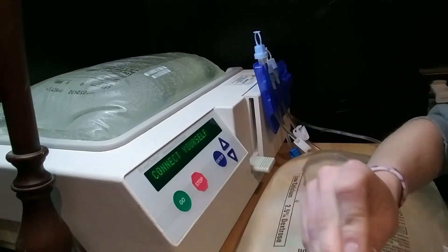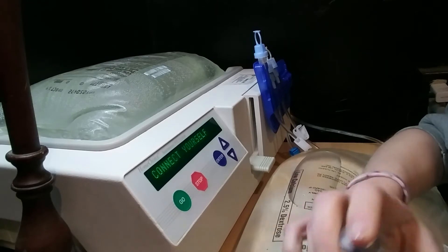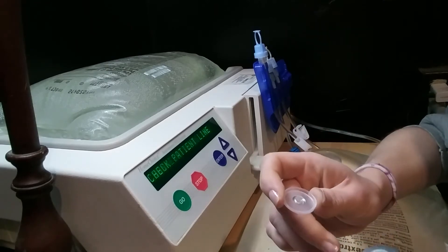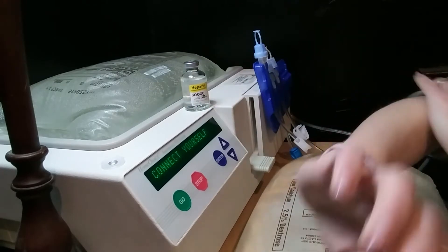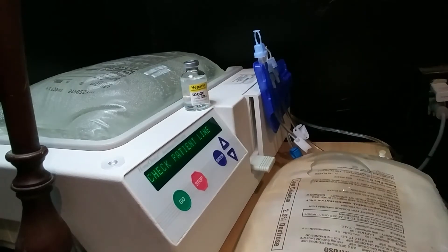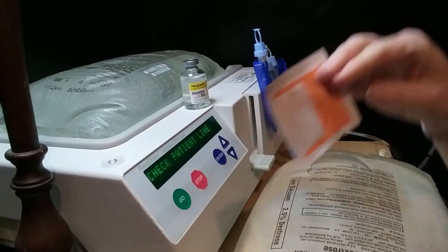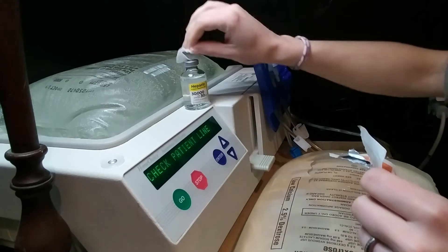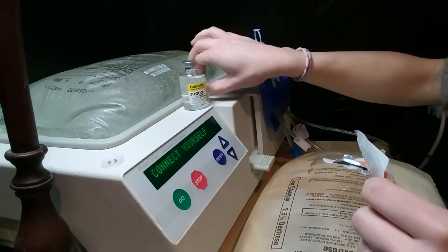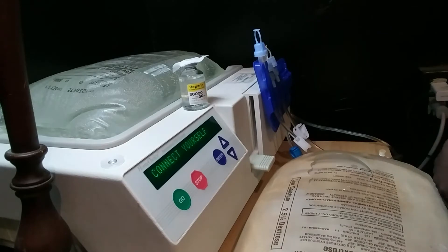Each bottle of heparin is good for a month from when you open it. I'm going to set that aside and use these little alcohol wipes. I'm going to put an alcohol wipe on top here because we're always wanting to be sanitary.